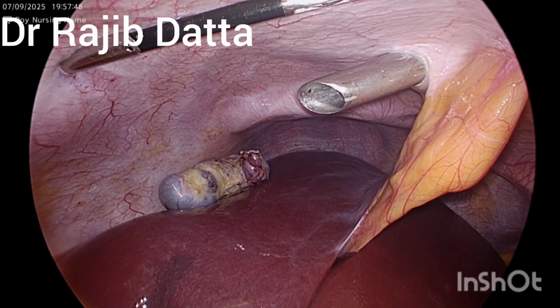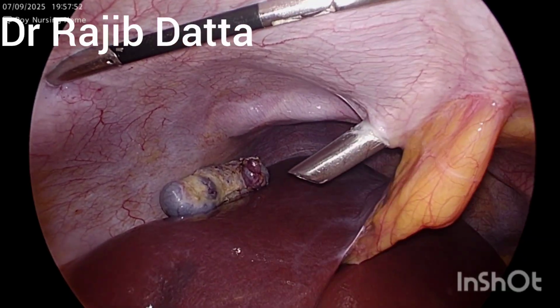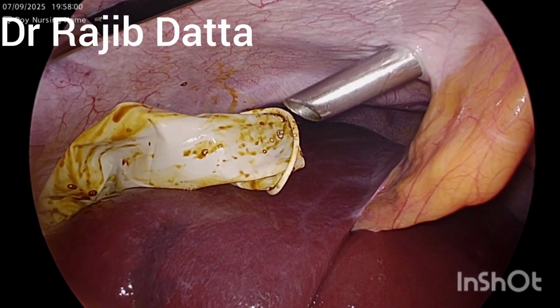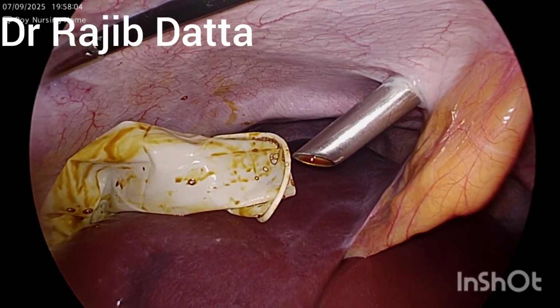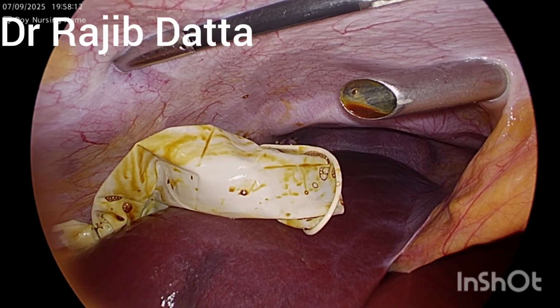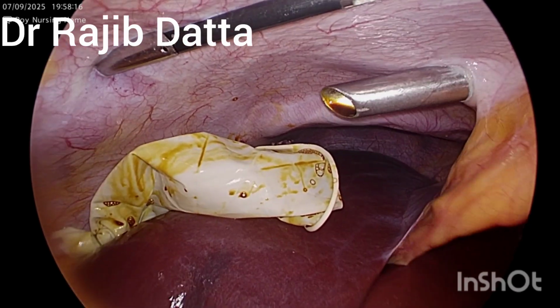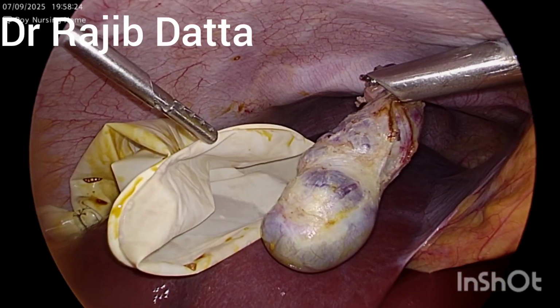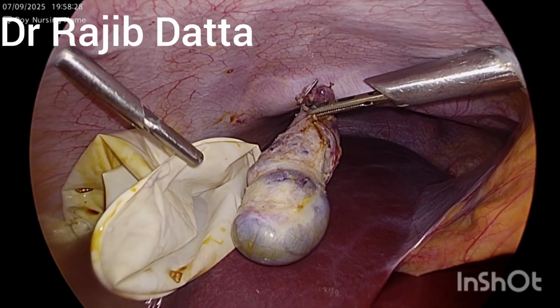And now our next job is, this is the endo bag. Here I have used gloves soaked with betadine. It's my preferred technique of retrieval of this specimen.